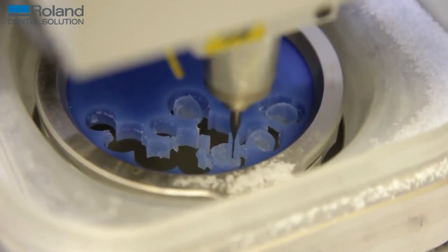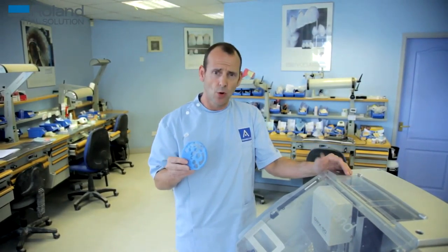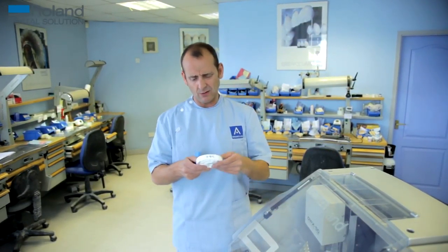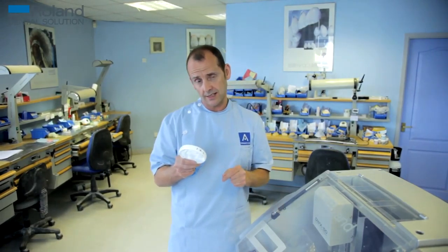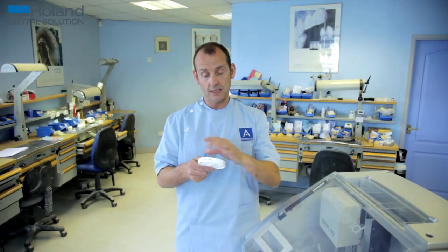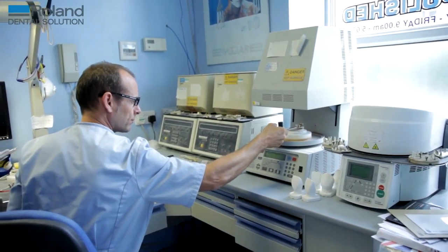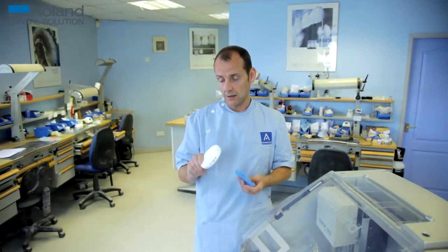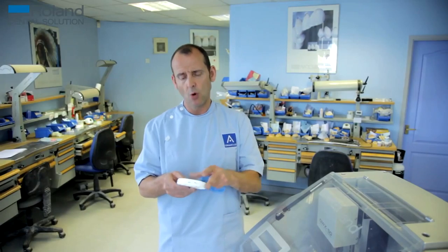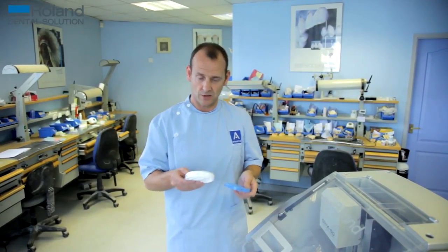On the wax disc we can fit about an average of about 28 units, depending on whether they're molars or anterior teeth. For zirconia, you can fit about 22 on a zirconia disc, because the zirconia ones are milled bigger than they need to be, and then when they're sintered — when they go in the furnace to be sintered — they shrink back. So because they're bigger, obviously you can't fit as many in. But still you can get about 22, maybe more if they're small anterior teeth — you can push it to about 26 or 27 sometimes. Depends on the cases really.